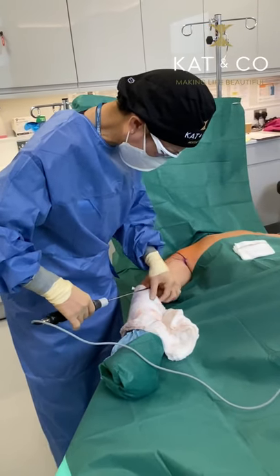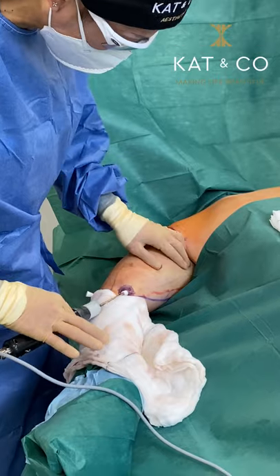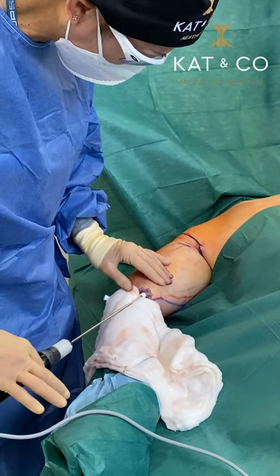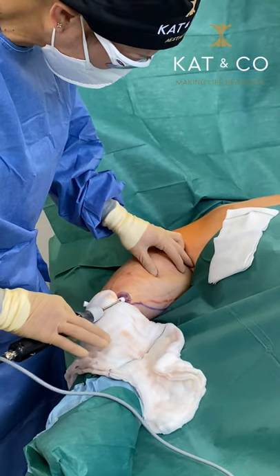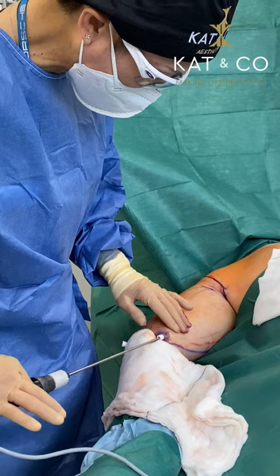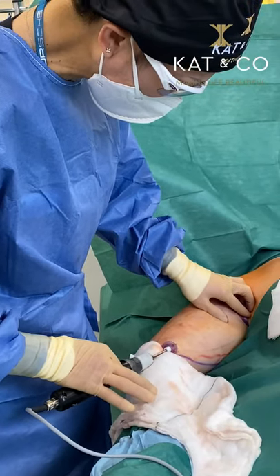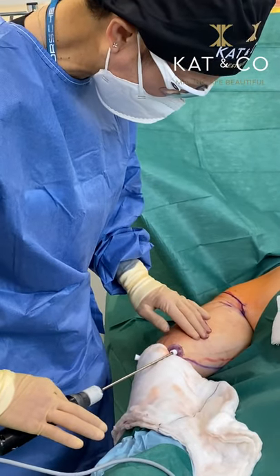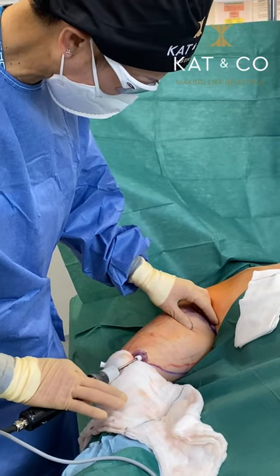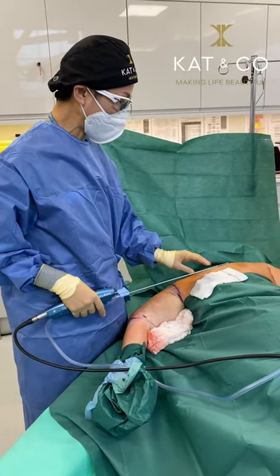Because of the energy it's like putting a knife through butter. You can see how I'm just using two fingers and it's just gliding in, as opposed to conventional liposuction where I would be shoving things very hard. That's the beauty of vaser — it's very non-traumatic, preserves the blood vessels so there's very little bleeding, minimal damage to the nerves because it's very specific for fat tissue, and the skin tightening element is 50 percent more than conventional liposuction.